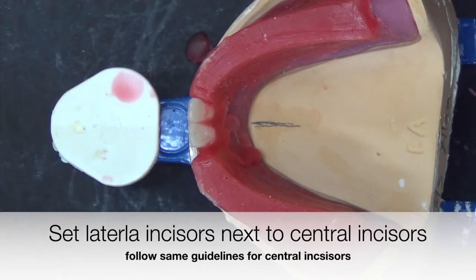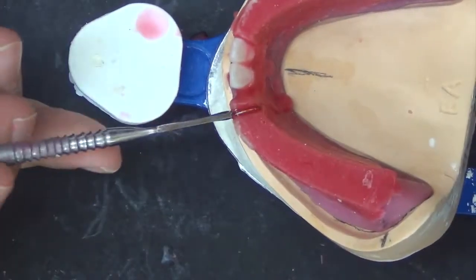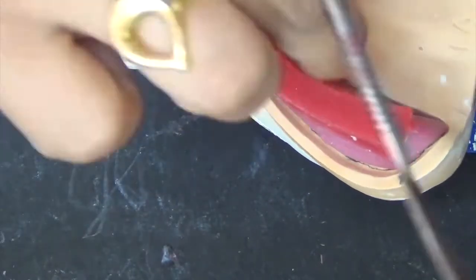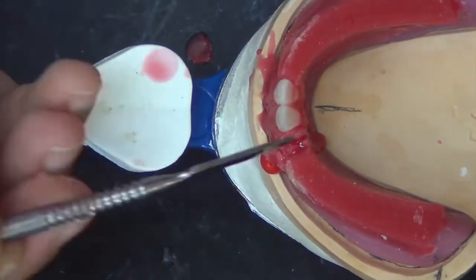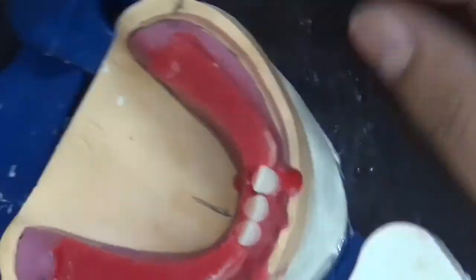Position the lateral incisors next to the central incisors, with the long axis directed toward the residual ridge. The incisal edge should be at the height of the occlusion rim, and continue the 1 to 2 mm horizontal overlap between the maxillary and the mandibular anterior teeth.